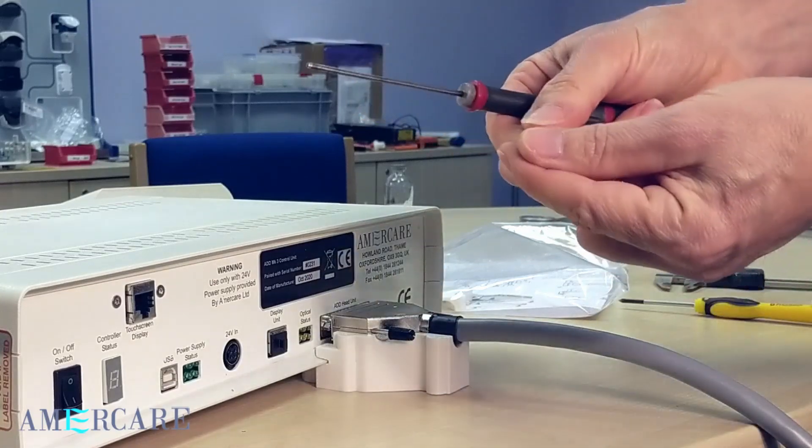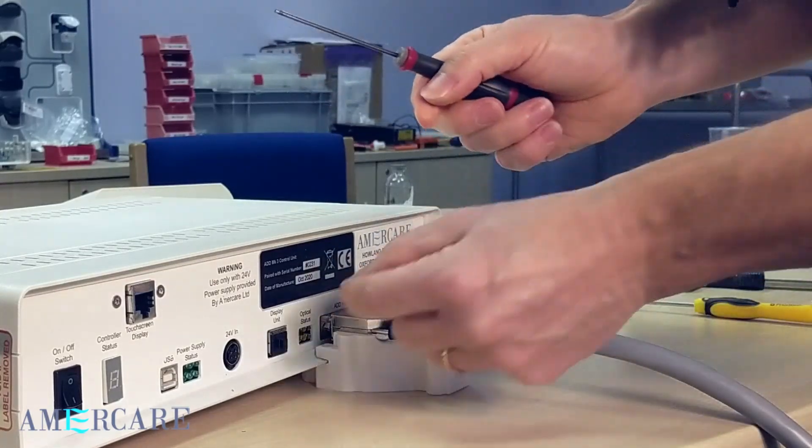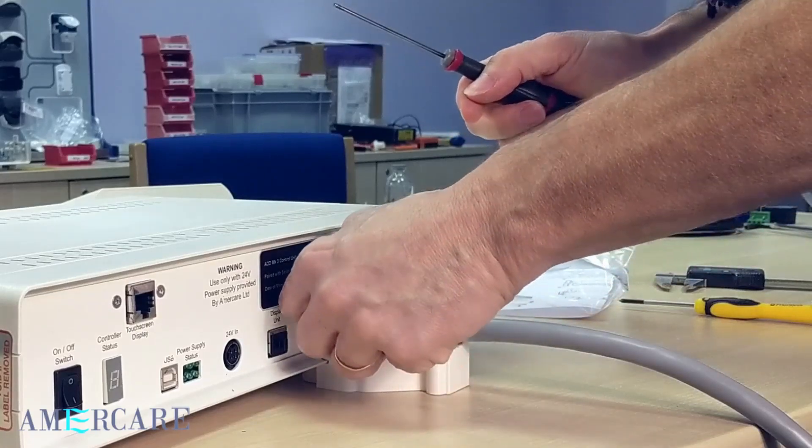This requires a 2.5mm Allen key. Simply drop the two screws into the holes and lightly tighten them down.